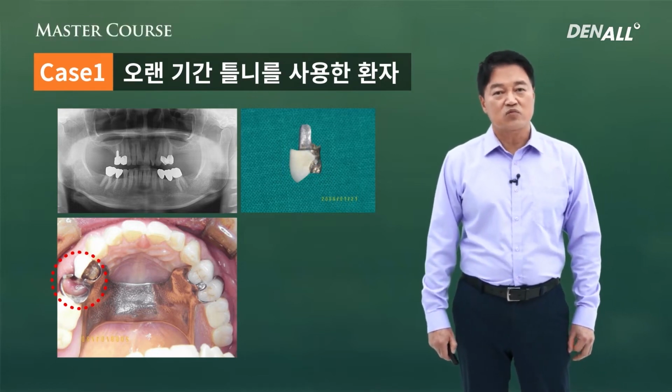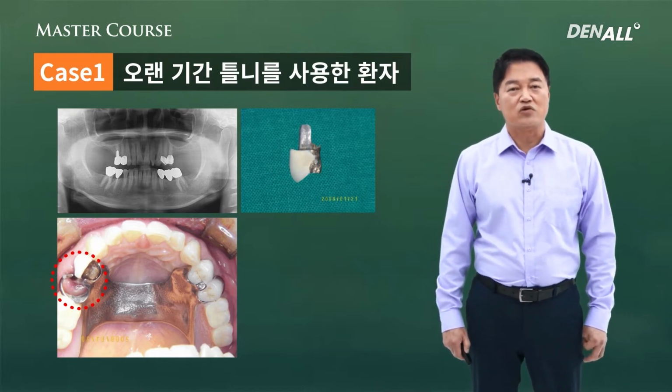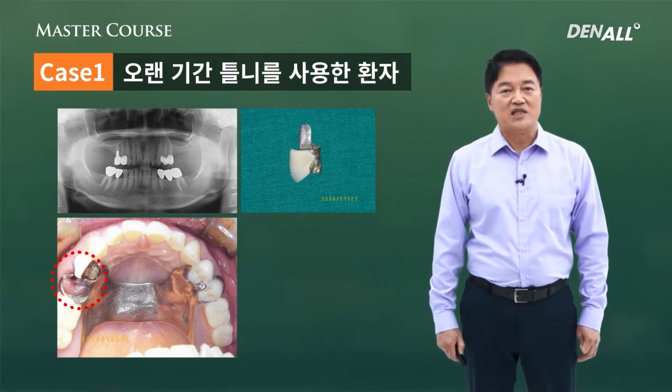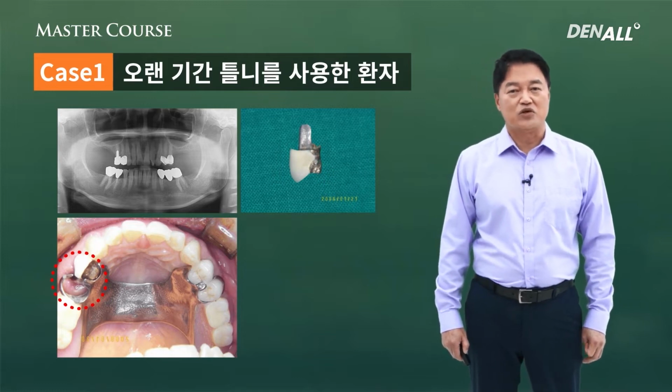If the patient received implant treatment from the start, in the top left, the surveyed crown would have remained as a natural tooth, and the bridged tooth, the patient would have been able to use it for a long time.